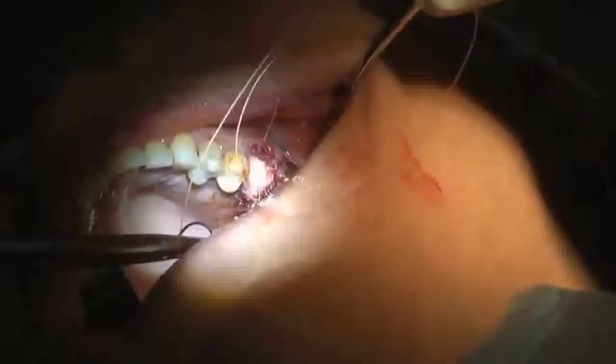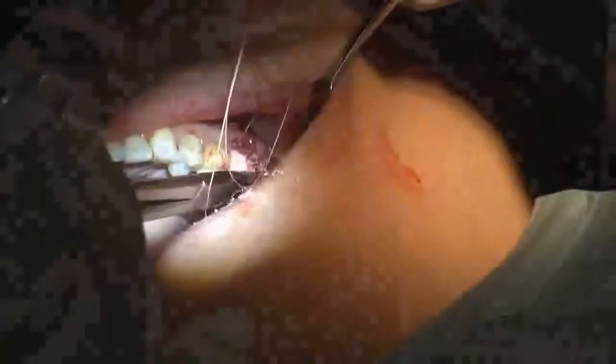Once the Periacryl is in place and the socket seal is secured, I like to put in a suture just to make sure the socket seal doesn't come out once the bond between the gingiva and the socket seal is released.